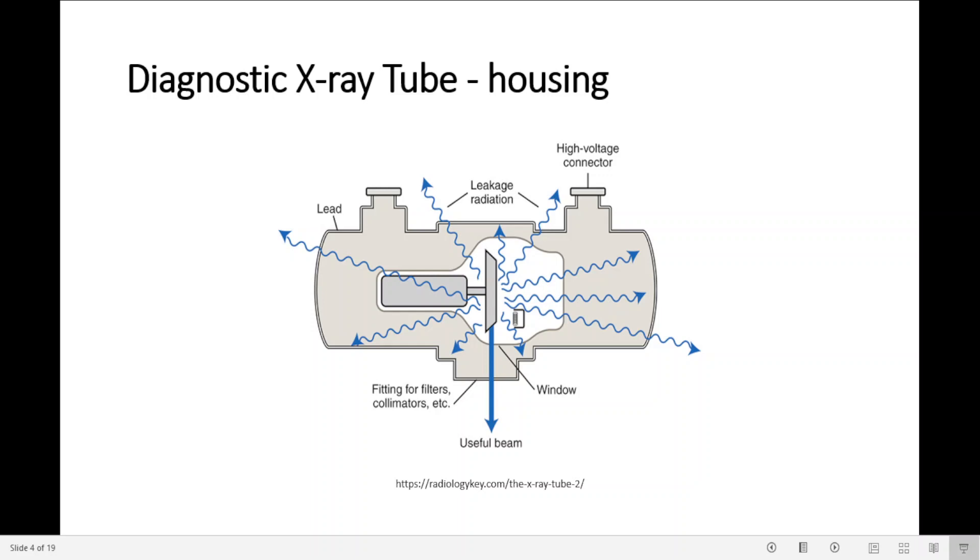Keep in mind that if X-ray tube voltage is at 100 kVp or less, the efficiency of X-ray production is less than 1%. 99% of input energy is converted into heat. Therefore, tubes need to be designed to dissipate the heat. This has been achieved in some tubes by conduction of heat through a thick copper anode to the outside of the tube, where it is cooled by oil, water or air, and the rotating anodes.